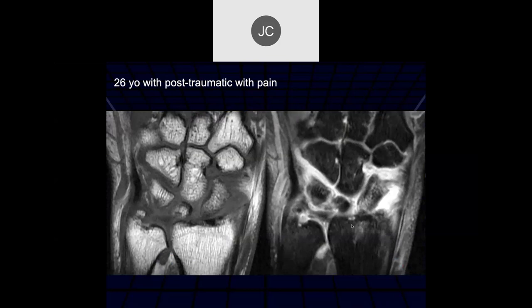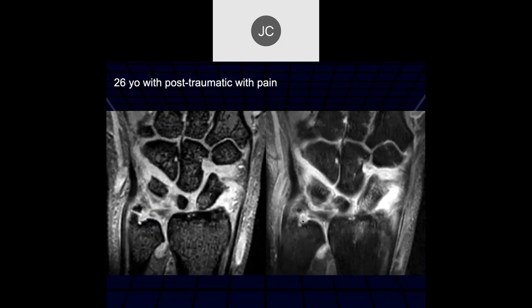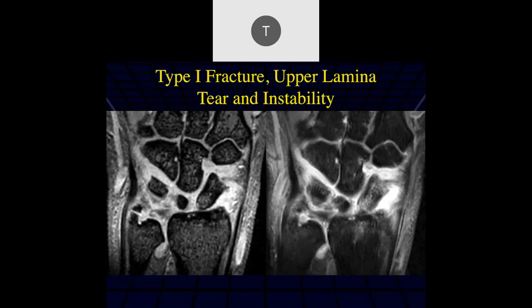Taysen: it looks like we might have a foveal attachment tear, and there may be some post-traumatic irregularity of the ulnar styloid as well — probably a fracture of the ulnar styloid and a tear of the foveal attachment. The lower lamina is attached to the unstable bone fragment and the upper lamina is torn here.